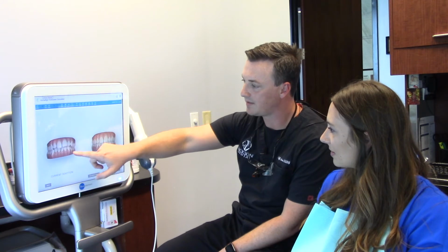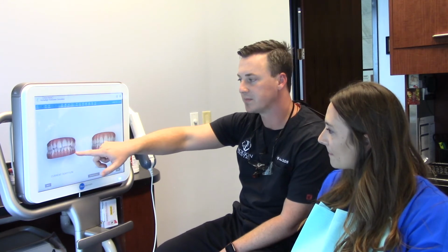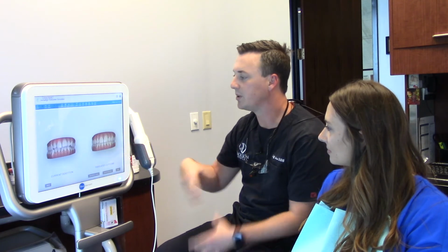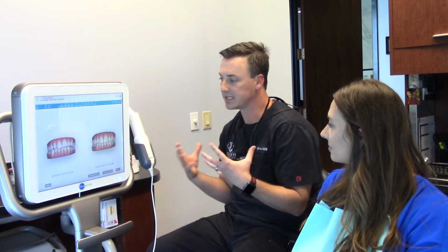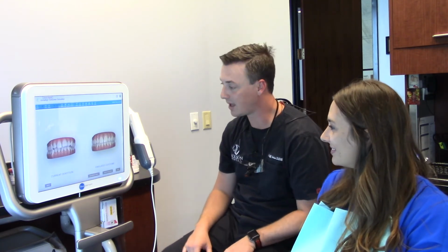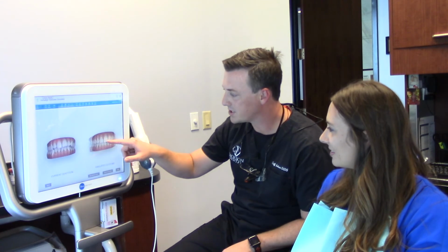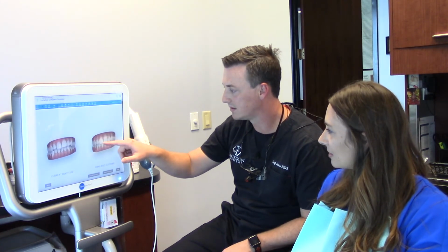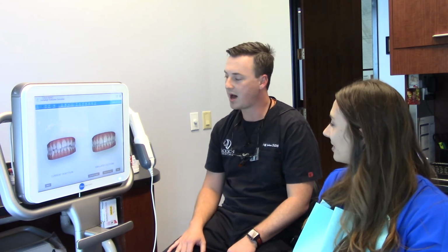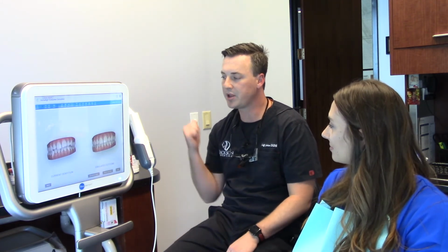On the left here, you can see your current smile and how the teeth are positioned. On the right side is what we would look like after Invisalign is over, putting the teeth back where they belong. What do you think? It is wow, right? Yeah. All right, any questions about any of this? No? I'll send this to you through an email so you can take a peek at it and play with it tonight too.